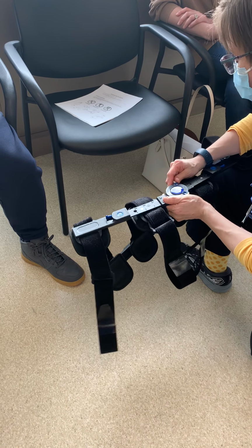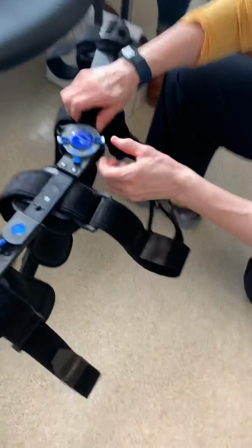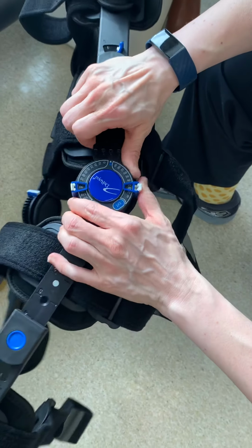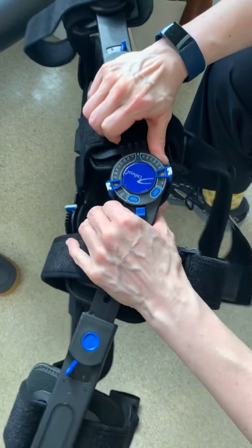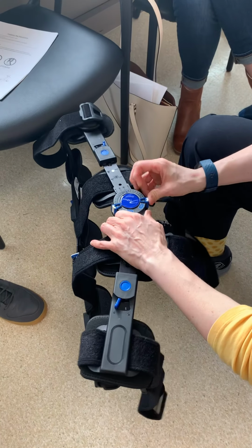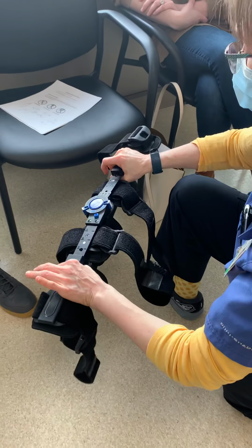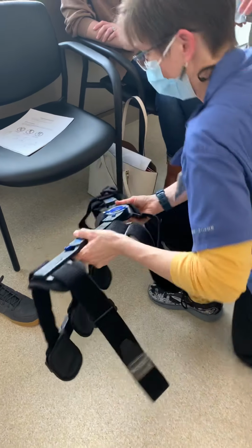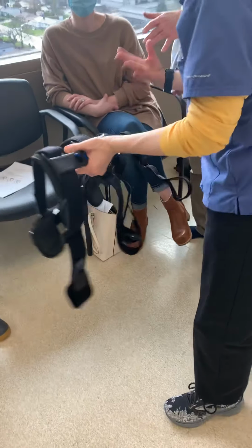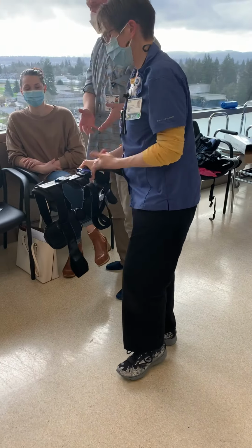Sorry guys, I swear at these a lot when I have to do them. So say they want him to go to 90. It says like 0 to 90 on the orders. So you do 0 on that, and now it's going to allow them to go that far. It's good for us to know too, these things are a wrestling match to get set. It's good, because if we're wrestling with it, we think, oh, we're doing something wrong. It's a wrestling match. It is.